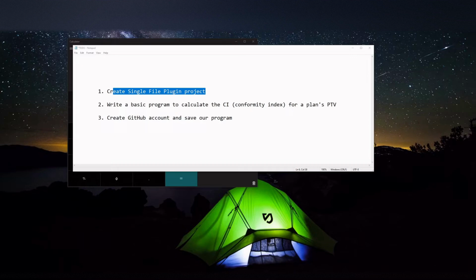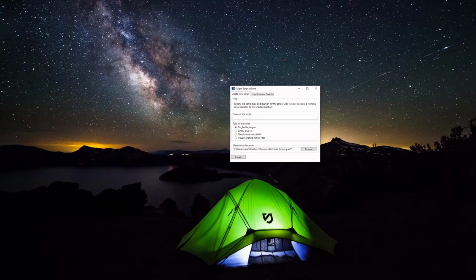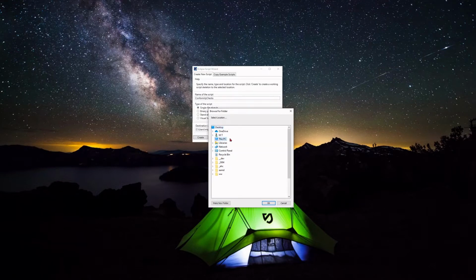So I'm going to run the script wizard in version 15, and it looks like this. And I can close this. I'm sorry that this is really small, but I'm going to name it, so I'm going to call this conformity check. You can call it whatever you want, but we'll call it conformity checks. Single file plugin, and then I want to change the location. So we'll just click here and then here.